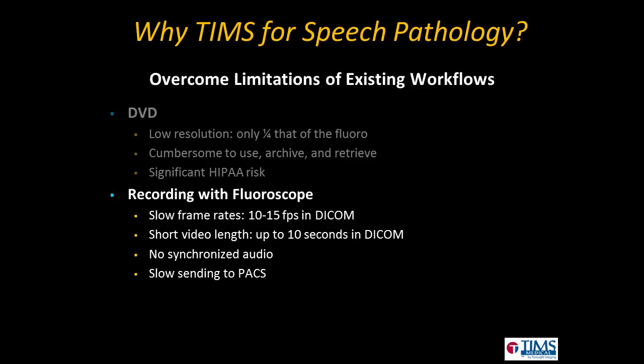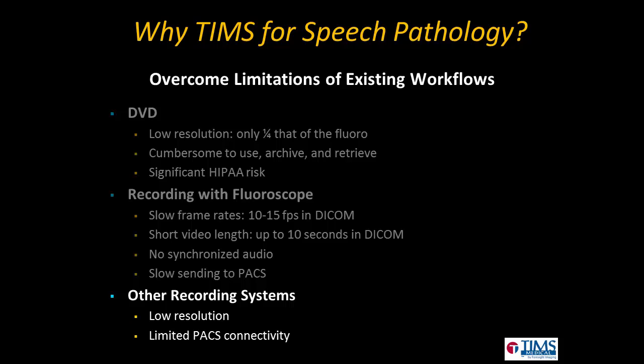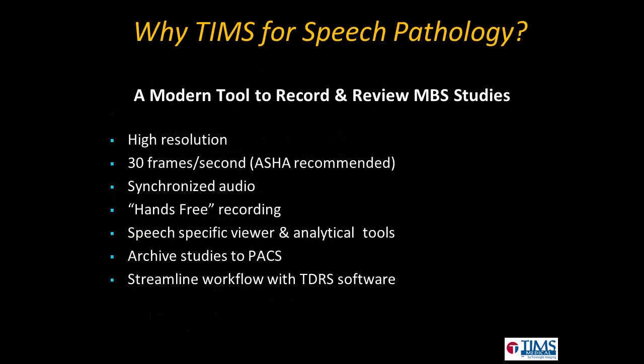After the study's been recorded, the fluoroscope is needlessly tied up as it takes its time sending the study to PACS. Other recording solutions on the market are typically also low resolution and often don't allow you to send the studies directly to PACS. The TIMS system overcomes all of these limitations.